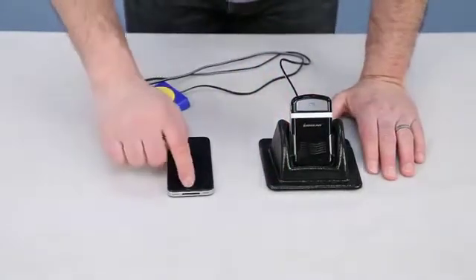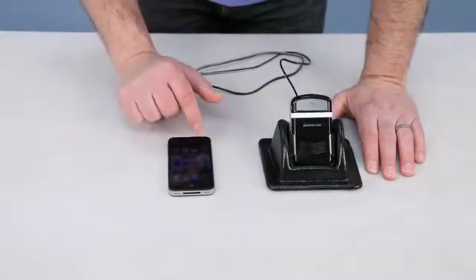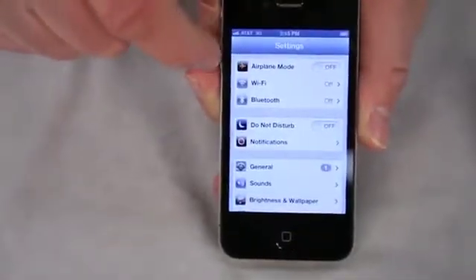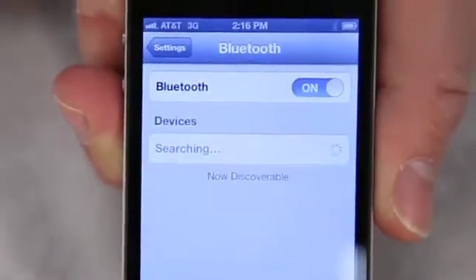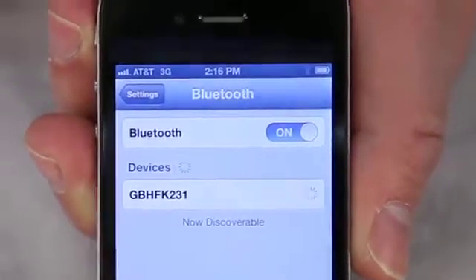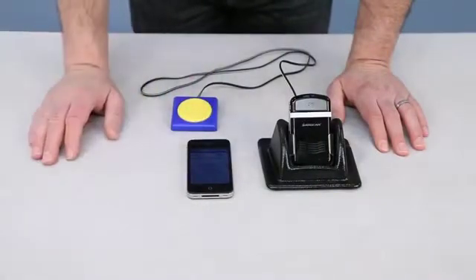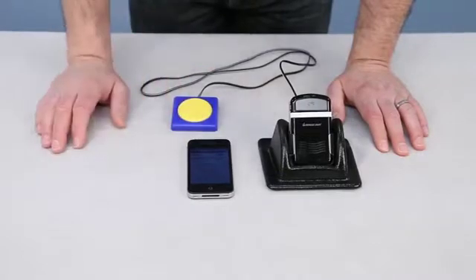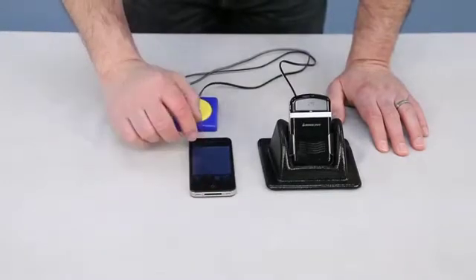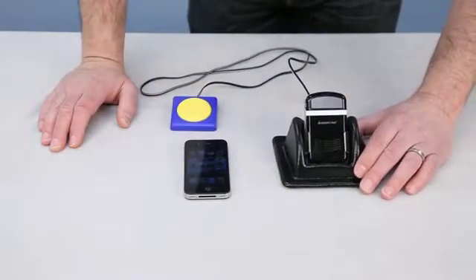Plug in my switch. What you're going to want to do is go into your phone's settings and make sure that you turn on your Bluetooth. This is now paired with my iPhone — your other type of smartphone or cell phone will let you know once the pairing is successful. Once you do that you can close out your settings and it will give you about a 30-foot range, so you can be about 30 feet away from the phone.